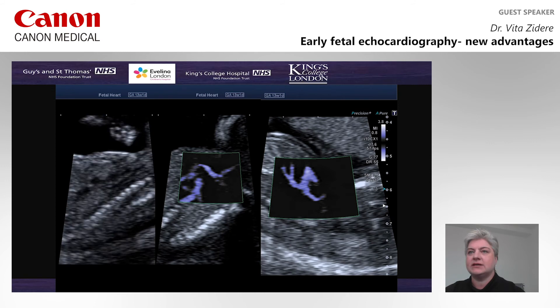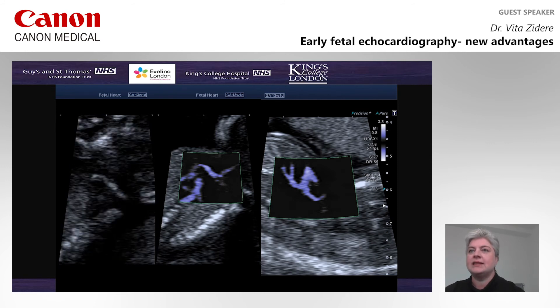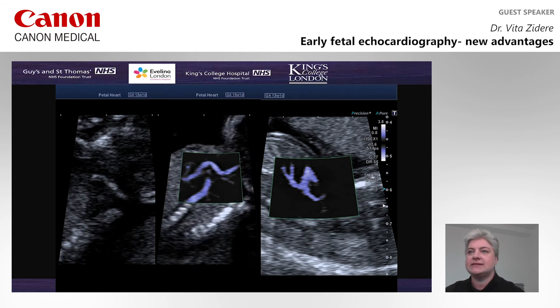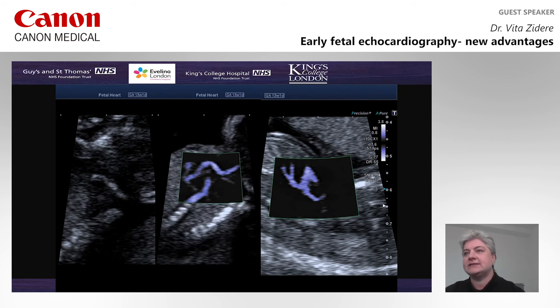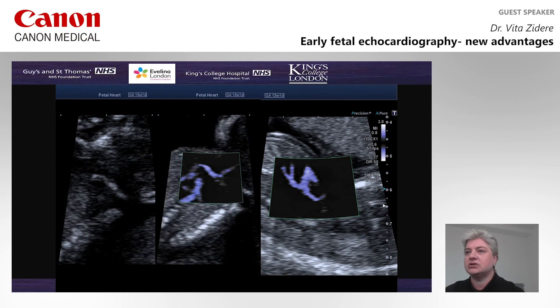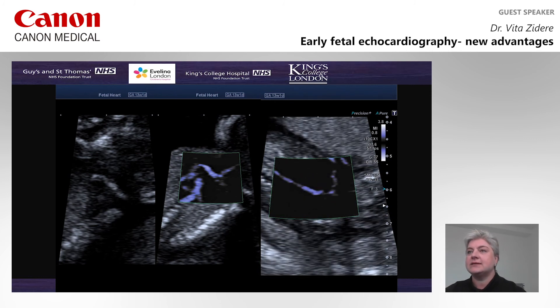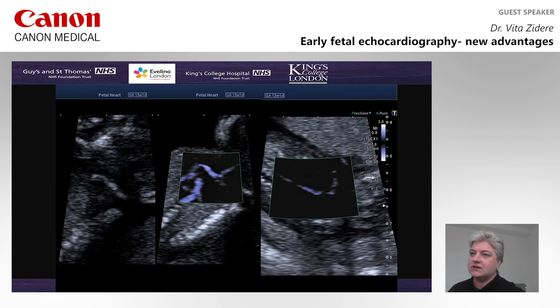Looking at the SMI image, we can see that there is a prominent ductal arch and hypoplastic aortic arch. Above it, there is a innominate vein joining the SVC. Slightly from a different projection, again, we can see and appreciate how hypoplastic the transverse aortic arch is, giving rise to the head and neck vessels, and hypoplastic isthmus, giving a high suspicion of coarctation of the aorta in this fetus.